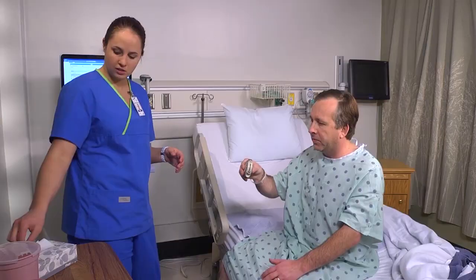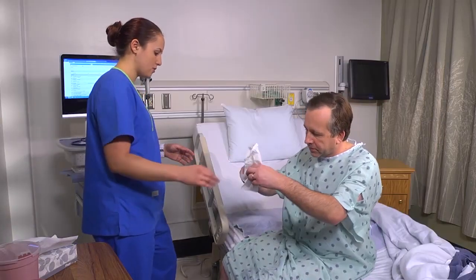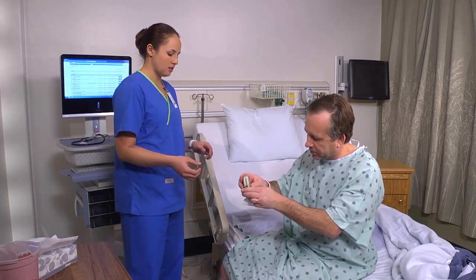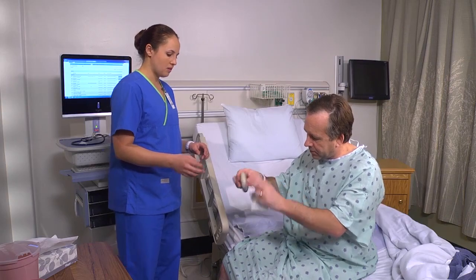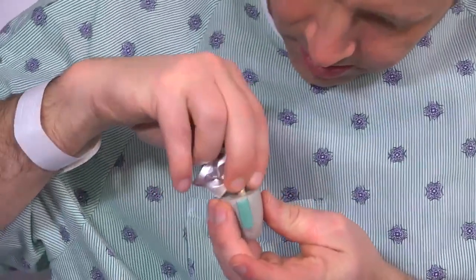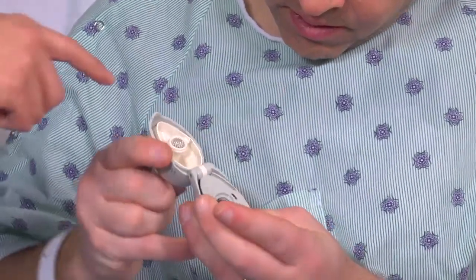And remind the patient to clean the device after every use. Always wipe it off with something dry. You don't want it to get wet. Close it up. Some medications are available in single-dose devices. Be sure the patient knows how to load the medication correctly.